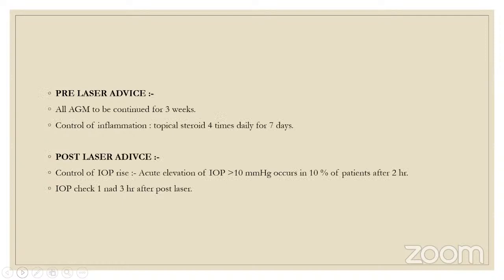The pre-laser advice is that all anti-glaucoma medication be continued for 3 weeks and inflammation controlled by topical steroid 4 times daily for 7 days. And post-laser advice is control of IOP rise, as acute elevation of IOP of more than 10 mmHg occurs in 10% of patients after 2 hours. And IOP check at the first and third hour after the laser.